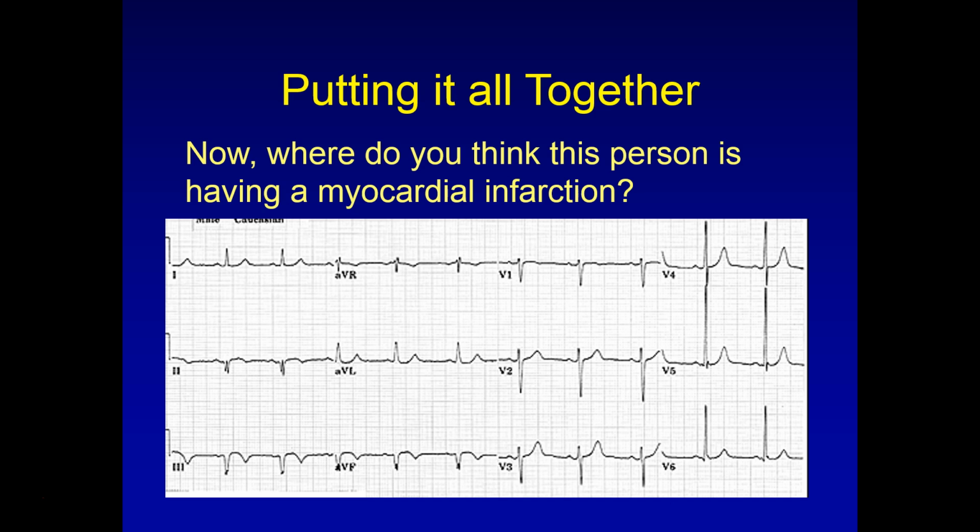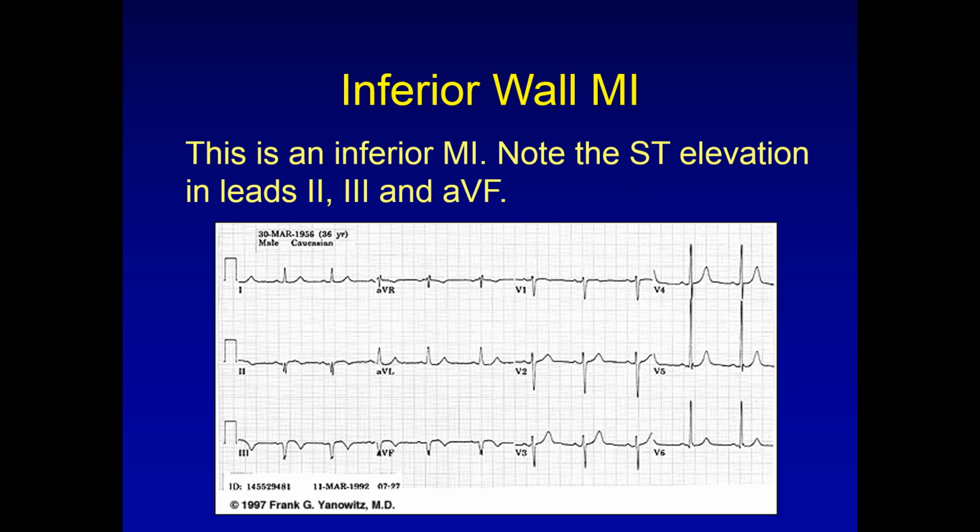Okay. Take a look at this EKG. See if you can spot ST elevation. Sometimes when the waveform is really low voltage, you have to look really, really close. But like right there, there's ST elevation. It's one small box above the isoelectric line. This is above the isoelectric line. This is above the isoelectric line.